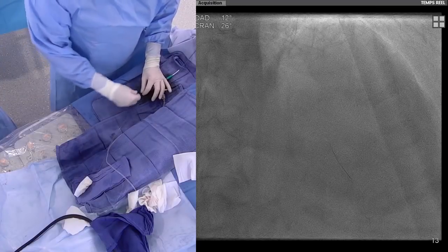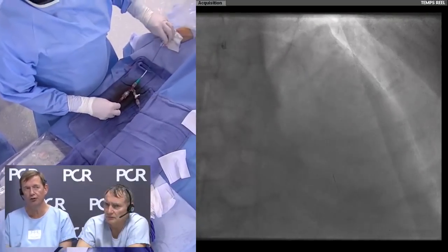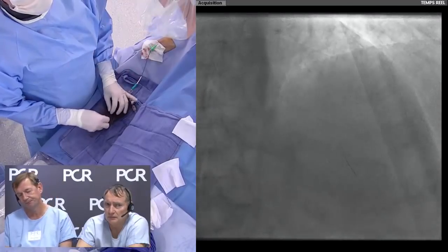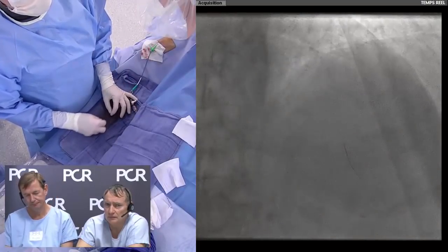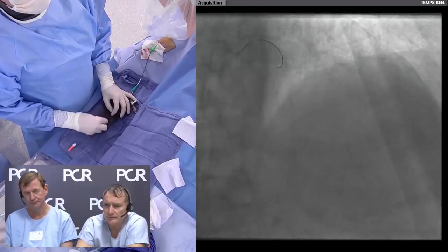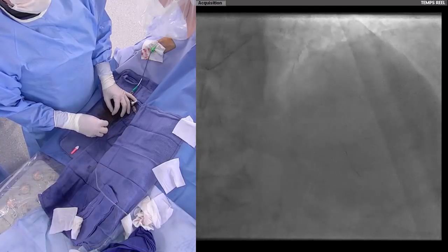We've had a request about the detail in the cocktail flush, Emanuela. I'm not sure if you can just take us through that. So the cocktail flush was saline, heparin, and nitrates. That is what is used here in Toulouse. And maybe the nurse can tell us the dose.